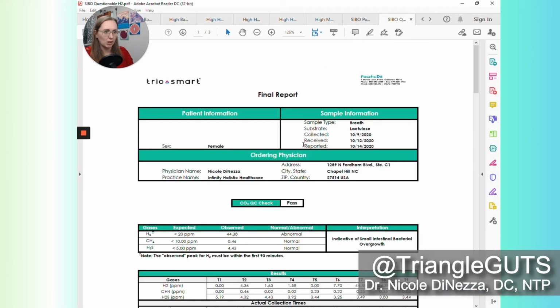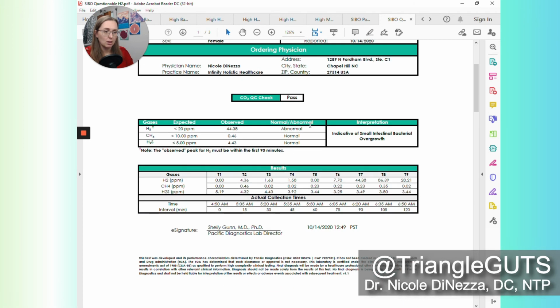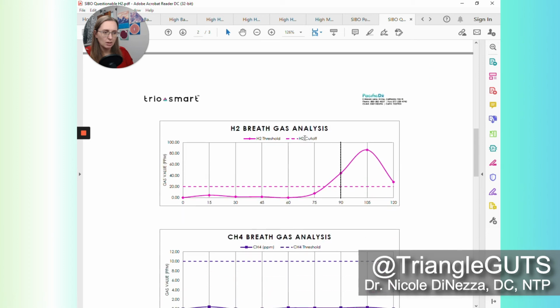Another one, we've got a couple more guys. This is another lactulose-based test, so we need to keep in mind that that's going to speed up the transit time. At first glance, it looks like they're pegging this as an abnormal hydrogen peak. It looks like all the samples are valid, so we get to march on.